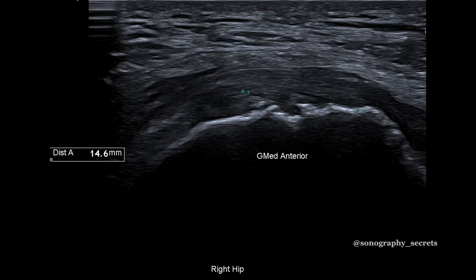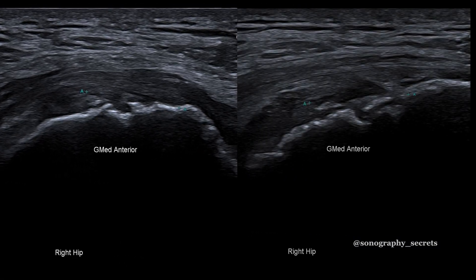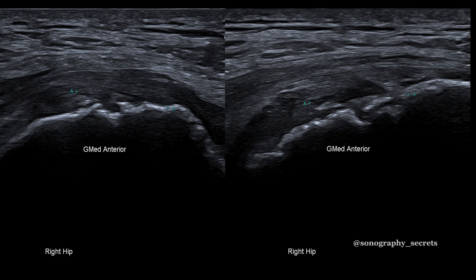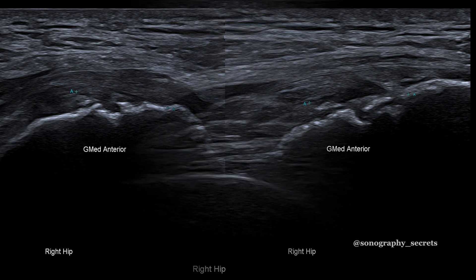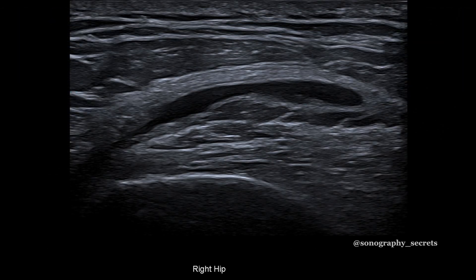In this case, we can see that there's irregularity of the enthesis, which is more likely to suggest a tear. We also see a large amount of fluid associated with this tear, and the only way we can see this is because of light probe pressure. Another common pitfall is that sonographers press too hard — they'll compress the fluid and make it a lot more difficult to identify a torn tendon.